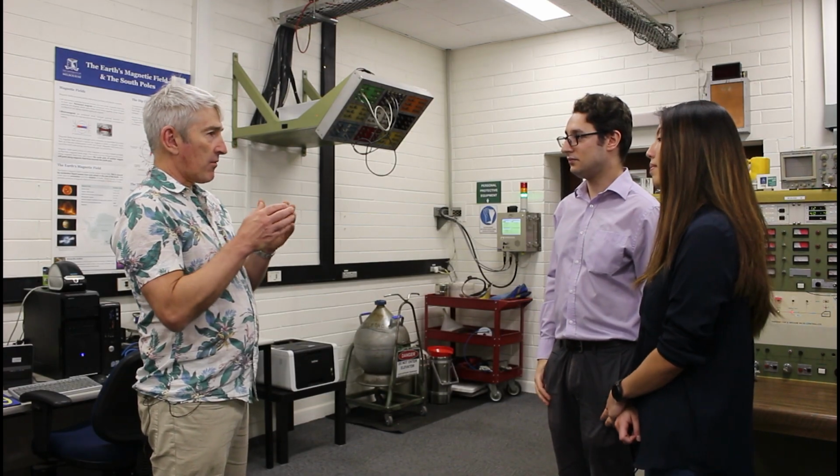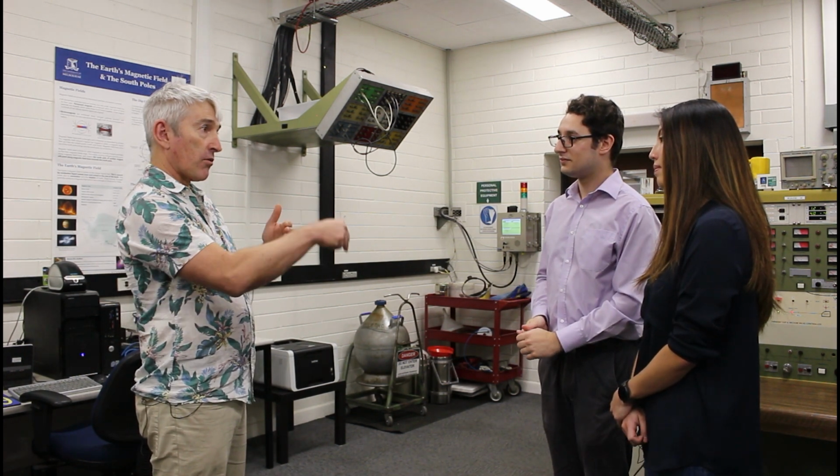So is it a good thing to have a range of energies? Like, does that mean you can get some that dump their energy in the front of the tumour and some go through to the back, all in the one shot? So the idea is to be able to transport all these beam energies with the same settings, but not all at one time, but to do that successive painting throughout depths just very quickly. A tumour is not going to be one depth. You're going to need a range of energies to be able to cover the full depth. So about 70 to 230 MeV covers around 3 to about 35 centimetres within the human body. So you basically want to cover that range so that you can treat all different kinds of tumours, depending where they are in the body and the size.